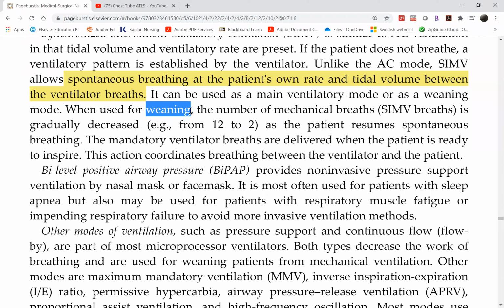Together with the respiratory therapist and the nurse, the doctor will say, okay, begin weaning protocol. They'll drop the respiratory rate every 2 to 4 hours, and we always draw ABG within 30 minutes of a change. So 30 minutes after you change the rate, we draw ABG, and if it looks good, it's normal, then we proceed with the weaning. We'll discuss the extubation procedure later.